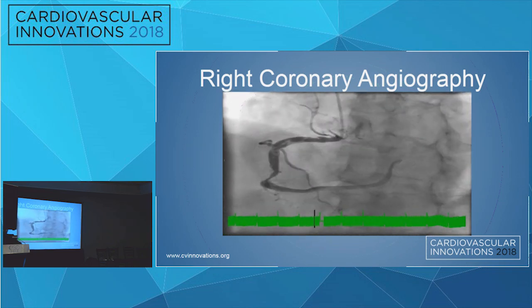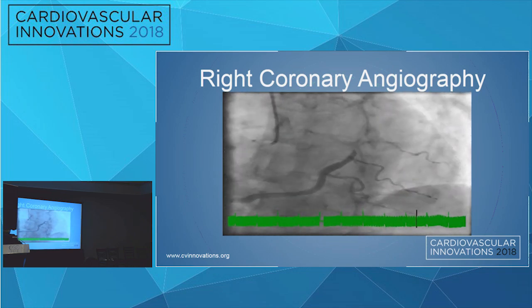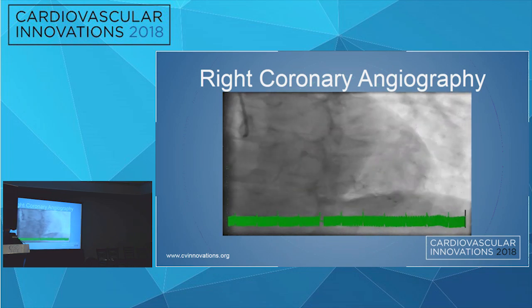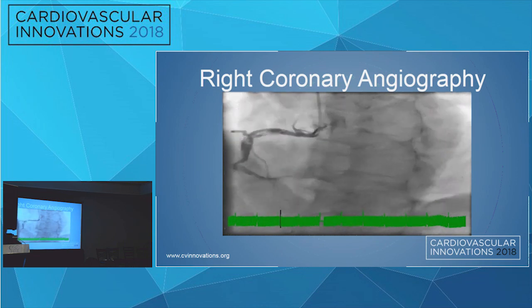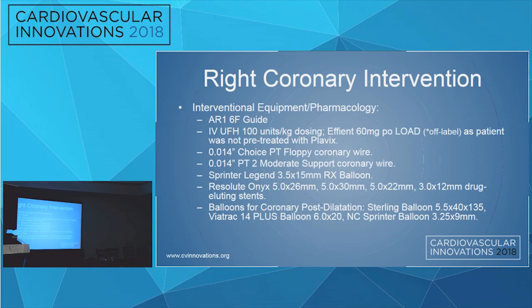And I thought to myself, well, this is single vessel coronary disease in a symptomatic indicated patient, so we should percutaneously revascularize her. She was stable. This is, again, an outpatient. This is not an ACS presentation.